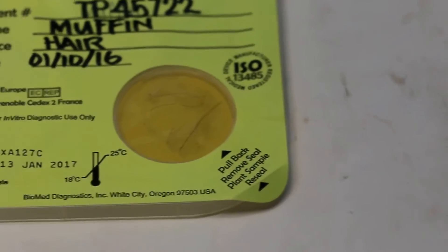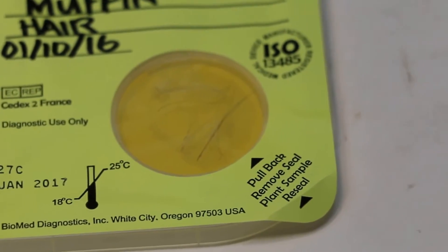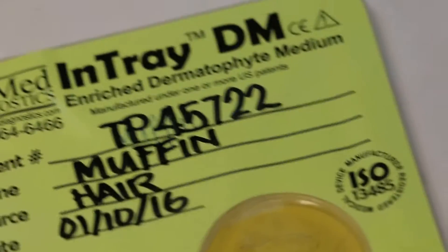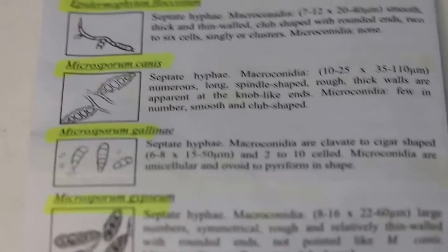If the color of the medium changes to red, then the vet will check under the microscope for the different types of dermatophytes. As you can see in this leaflet, they give you a guide on dermatophyte identification.